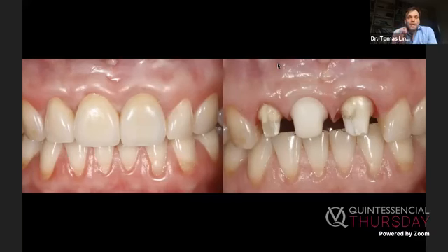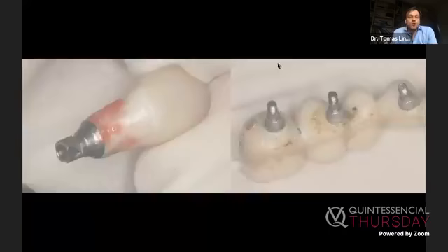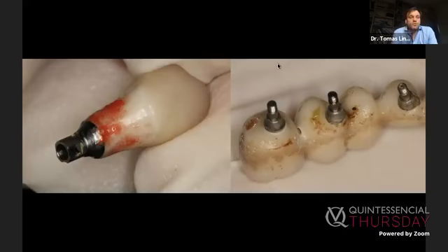Now, I'm not saying that only zirconia helps, but we can say scientifically that you have better tissues around zirconia compared to titanium abutments. And that's, I think, a very powerful thing, especially when you look that sometimes when you remove zirconia restorations from the implants, you have adherence of the tissues, leftovers of the tissues on the polished zirconia.